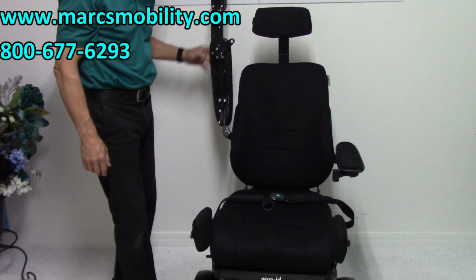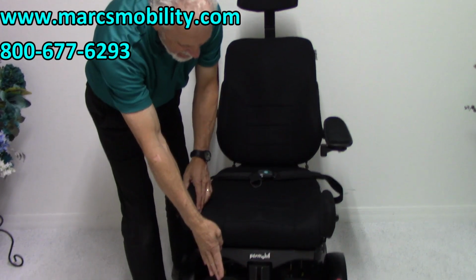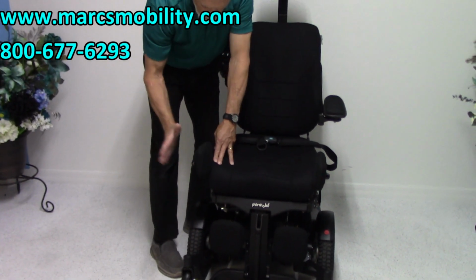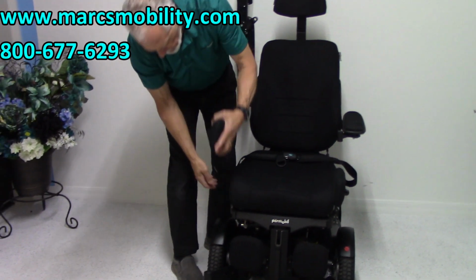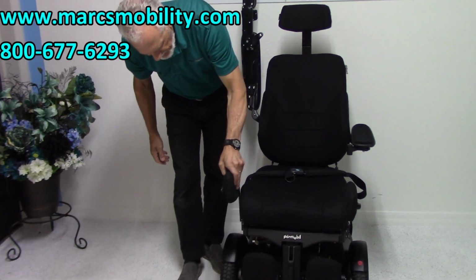The arms do flip up, like I said. You have lateral guards to keep your knees together so your feet stay on the foot plate, which is a great help. And these can be moved in more, or out, or back. You can go all the way back on this. You can have them here if you wanted to. It all depends where you want them.